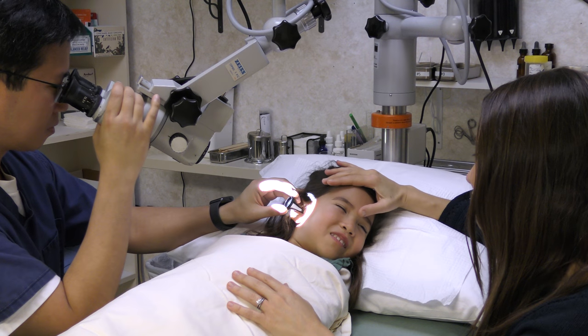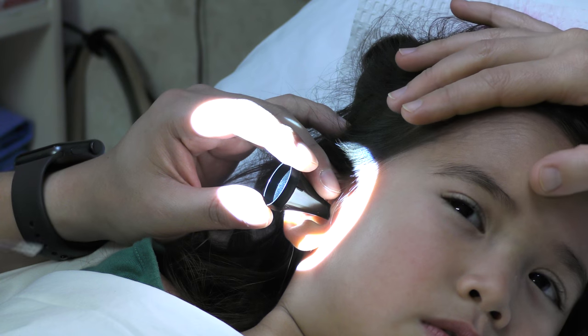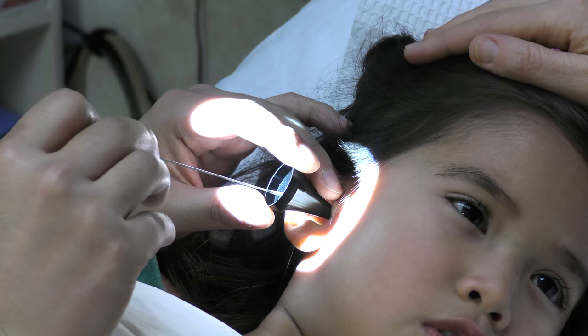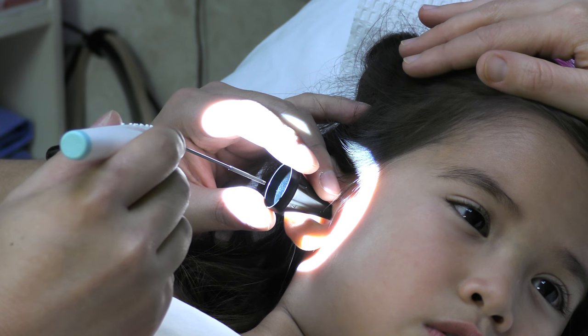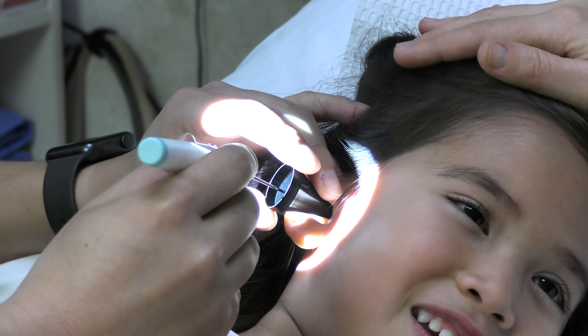Ear wax removal to expose the eardrum, topical numbing liquid applied with a sponge-tipped applicator, then device insertion to both incise the eardrum and place the tube with a single pass.